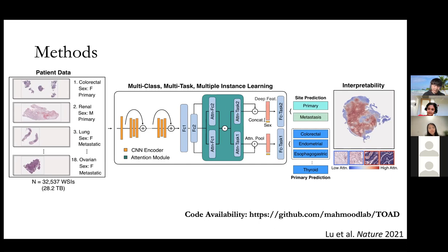And of course, at the time we came up with this framework, it was still the early days of computational pathology and weakly-supervised learning. Since then, people have tried to play around with GCNs, graph neural networks, and more recently, people have also tried transformers, which can model dependencies and context between different patches in your slide. For certain tasks, that might also give you a boost, at the cost of additional computational expenses.